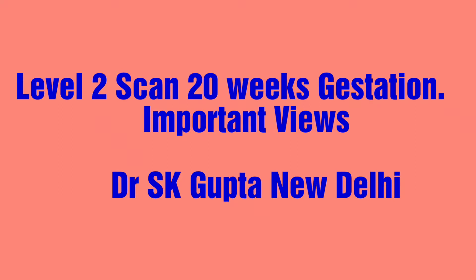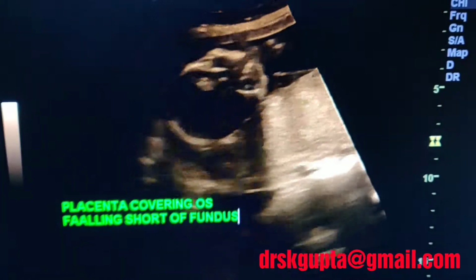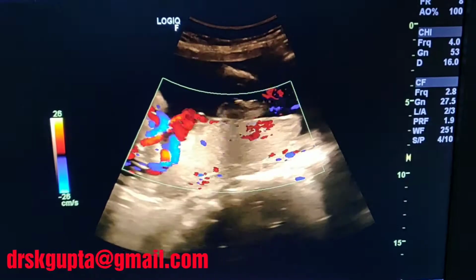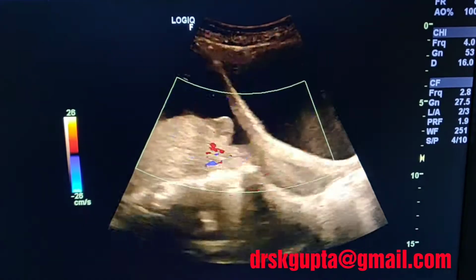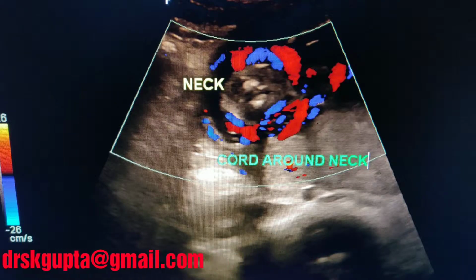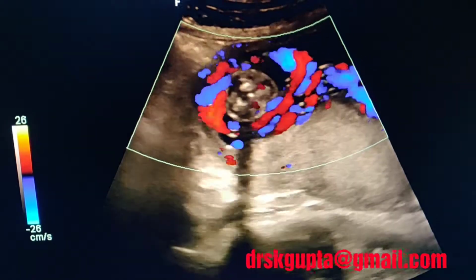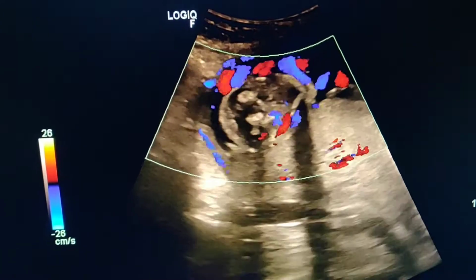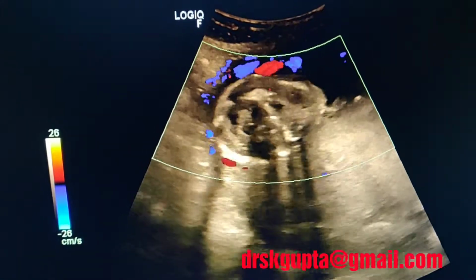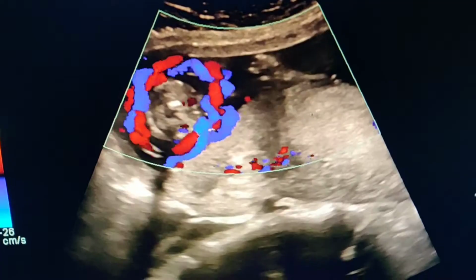Friends, today I'm going to say something about the level 2 scan. Incidentally, the clip shows the placenta previa and the baby has cord around the neck. You can see the beautiful cord around the neck. There are 2 loops of cord around the neck in this baby, and the placenta you find is falling short of the fundus and starting at the level of cervix, which makes sure that this is placenta previa. You see the 2 loops of the cord, beautifully looped around the neck.